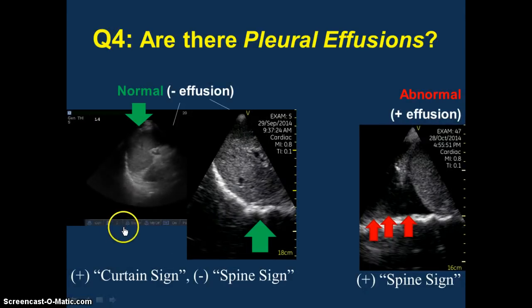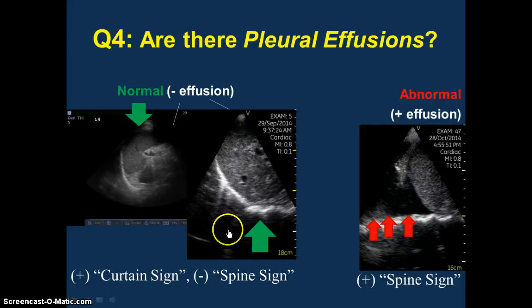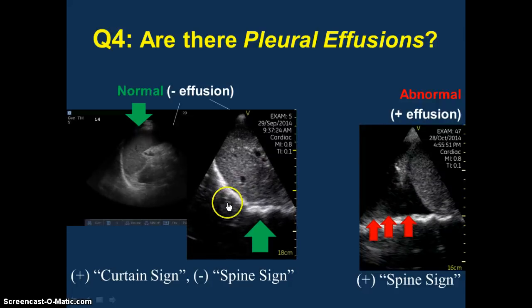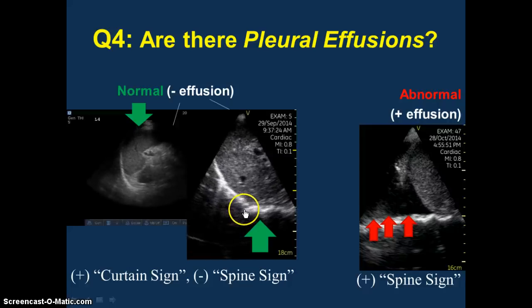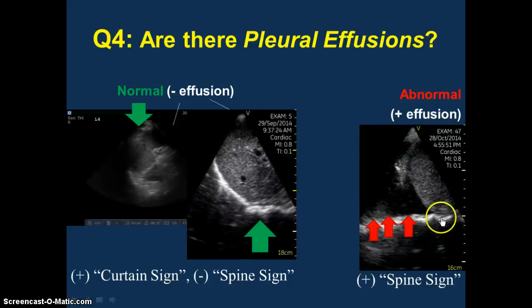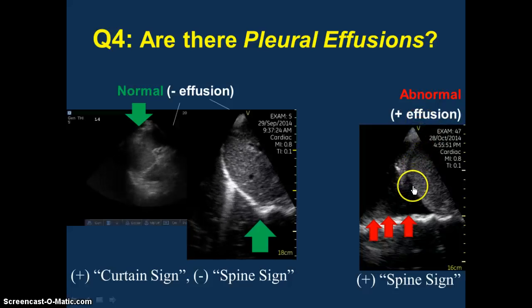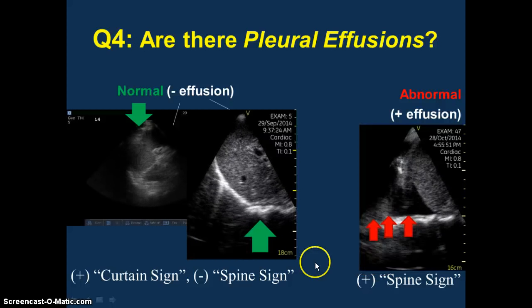Here you have an example of the curtain sign, where aerated lung is obscuring everything behind it. When the lung is surrounded by pleural fluid, you don't get that curtain sign because the ultrasound beam is actually able to travel through pleural effusion and show you what's on the other side. This is an example where it looks like there's liver extending past the anatomic boundary of the spine — a mirror image artifact suggestive of normal aerated lung with no effusion. When you can see the spine above the diaphragm, that means the ultrasound beams are going through the liver, through the pleural effusion, and showing you what's on the other side — that's a positive spine sign suggestive of an effusion. It can be very obvious, or it can also be subtle.